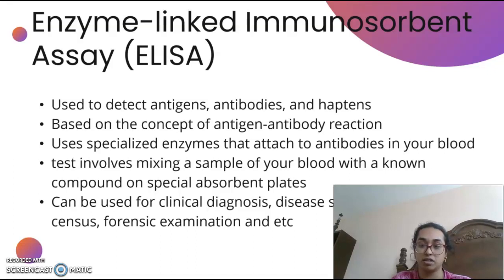ELISA is based on the concept of antigen-antibody reactions, and it can directly determine soluble antigens or antibodies within bodily fluids. In real-world applications, it can be used for clinical diagnosis, disease surveillance, disease census, forensics examinations, various veterinary purposes, and also agricultural plant disease diagnosis and verification.